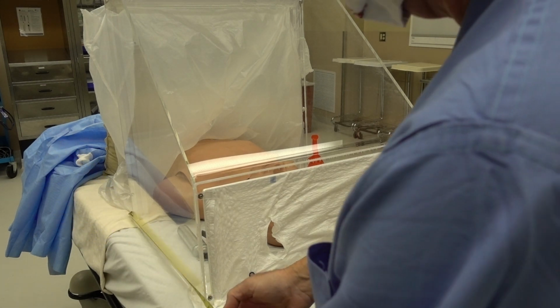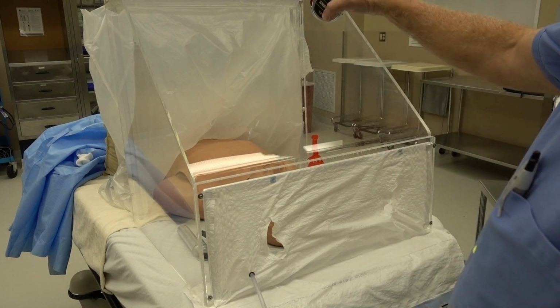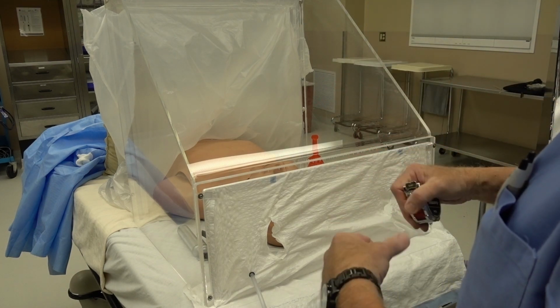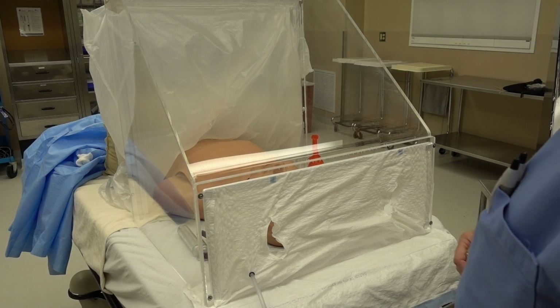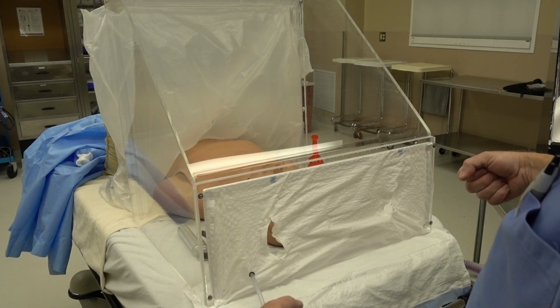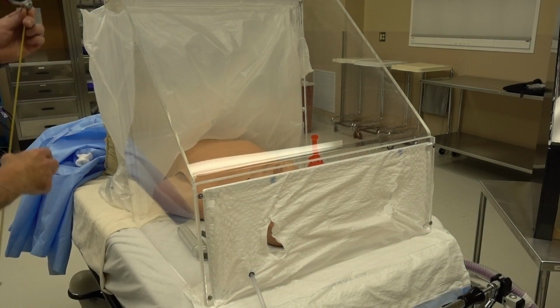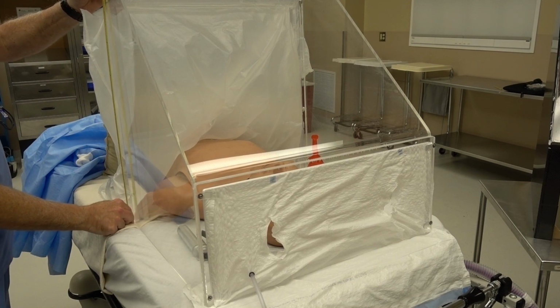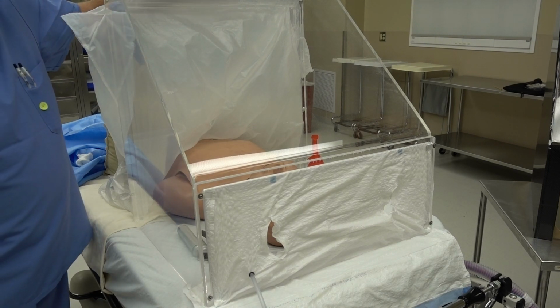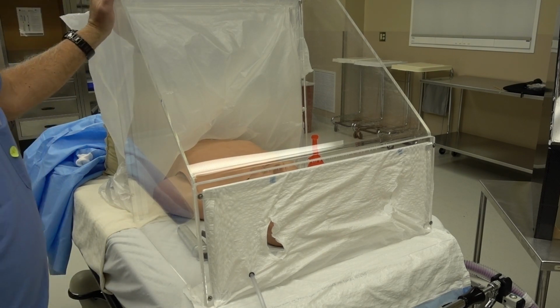Now this box is higher in the back to accommodate larger folks, or people are a little bit higher here, and you can adjust that bag. It's so big, you can put the inner one and stretch it and put it down on their chest or neck or belly, wherever you need to put it. And then the back one, backside you can pull out and lay a blanket on it or a pillow, and it'll totally seal. So the back should be 24 inches, and it is. The top is around 6 inches. And you can even place a mini iPad up here, and people can watch something if they were in the chamber for a length of time.